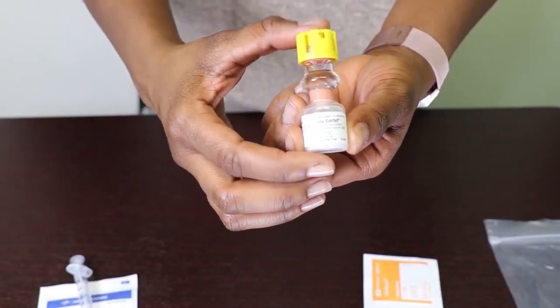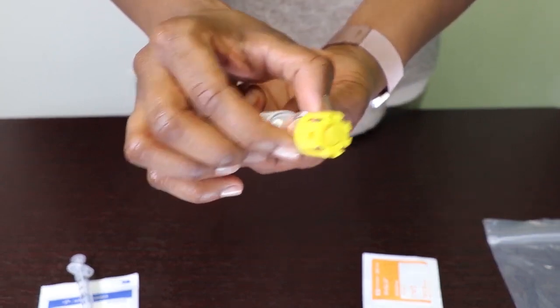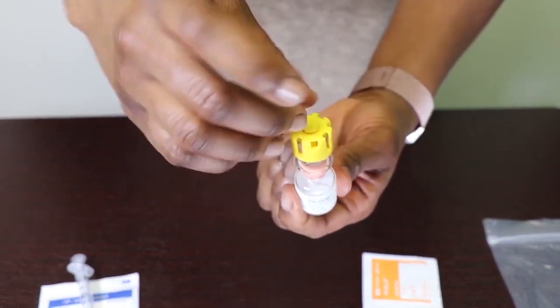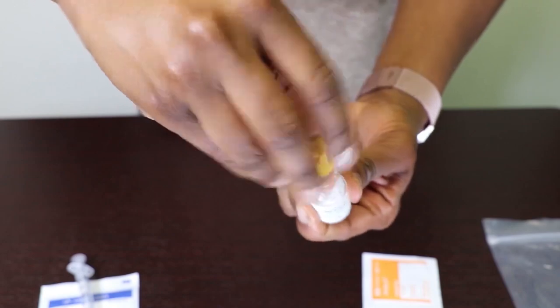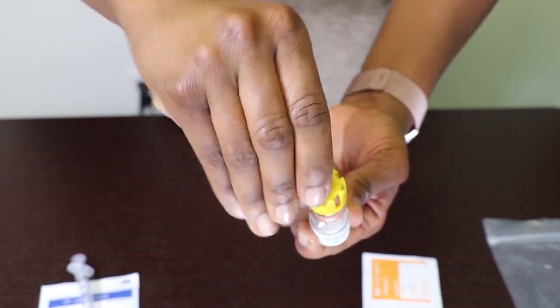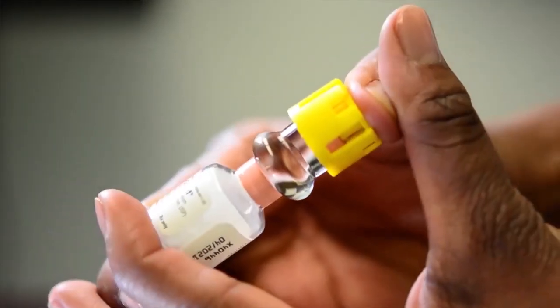To mix the medication, take the vial, remove the little yellow tab in the center, then push down hard on top of the vial to move the red stopper to allow the fluid to flow into the part of the vial that contains the medication powder. Gently swirl the vial to mix the powder and fluid. This will take under a minute.